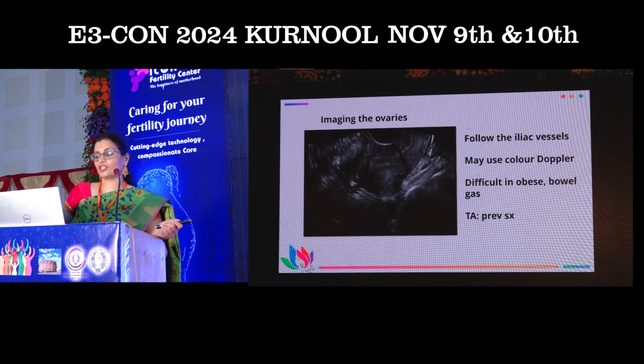Then how to image the ovaries. Once you have finished looking at the uterus, then coming to the ovaries.